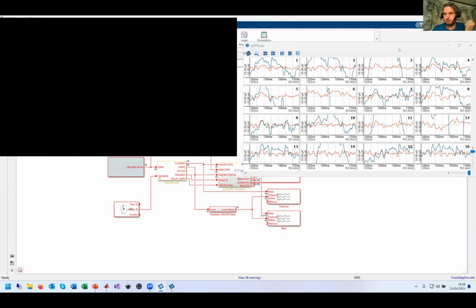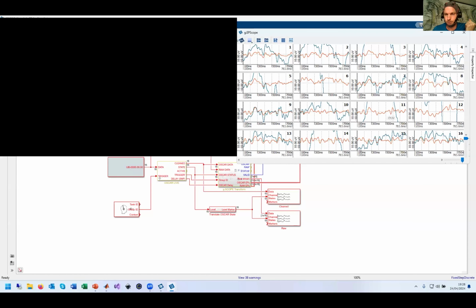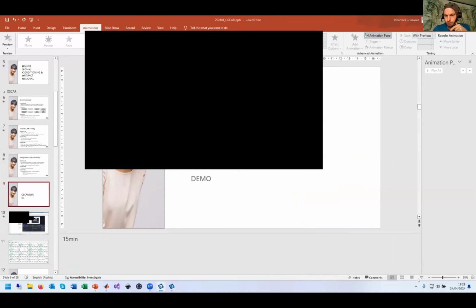So you have seen that I've done lots of stuff you should not do during an EEG experiment. And lots of the channels are contaminated with artifacts. You really cannot use them. But still, the response, and you have to look at the scaling, it's plus minus 10 microvolts. So this is still in the range of several microvolts. I have a consistent response with Oscar. Maybe I show you a result I recorded from before the presentation, because there it is easier to see.